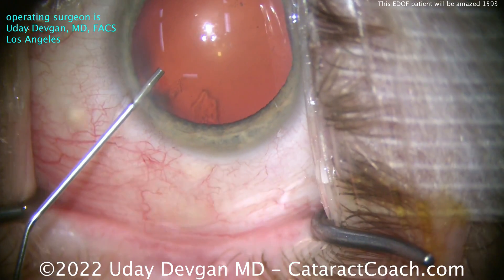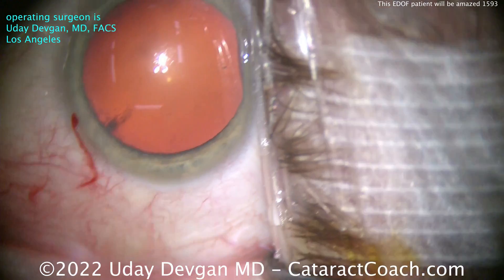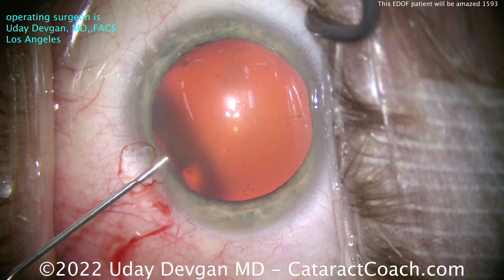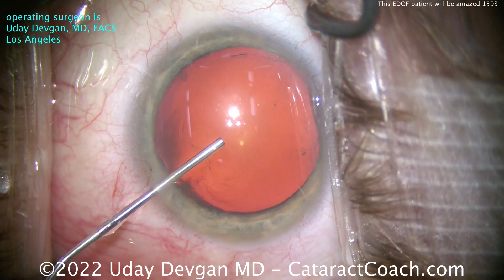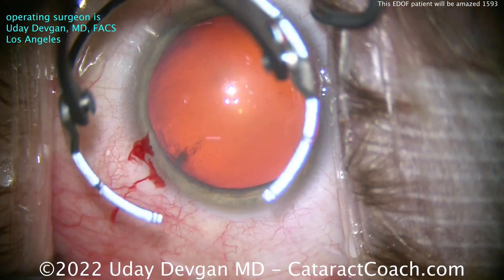Mathematically, minus 10 means one-tenth of a meter — 10 centimeters, or about four inches from his face — he has perfect focus for pulling out splinters or looking at diamonds. But for day-to-day life, having a focal point of four inches or 10 centimeters from your eye is not very useful. This patient is also very athletic, enjoys outdoor activities, and is really sick of wearing contact lenses.